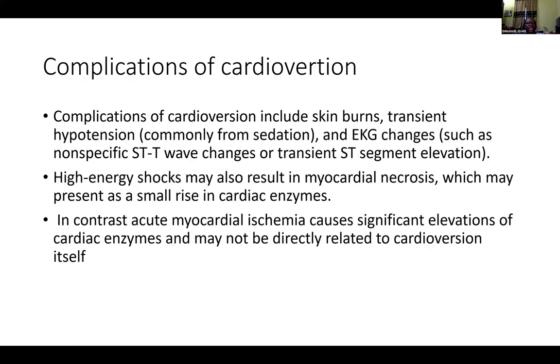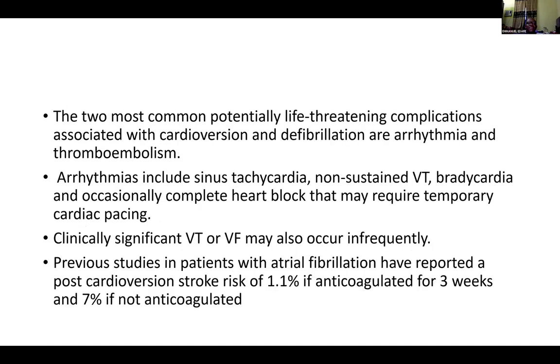Can there be any complication from cardioversion or defibrillation? Yes, there can be complications. One, myocardial injury can occur. Skin injury can also occur, probably because of not applying enough adhesive to the skin. Okay, I think this is the summary of my presentation today.